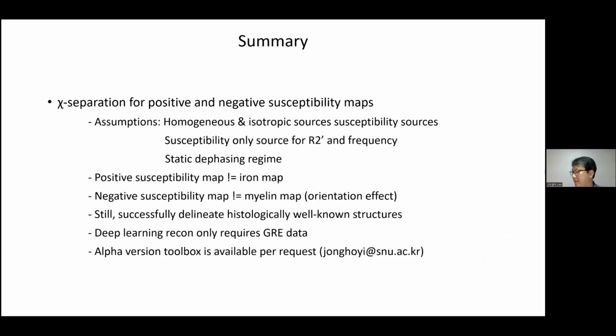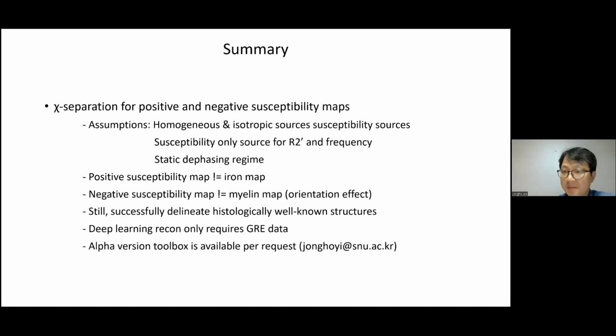So with that, let me summarize my presentation. Again, chi separation is a new tool. It is an advanced QSM tool that generates a positive and negative susceptibility map.